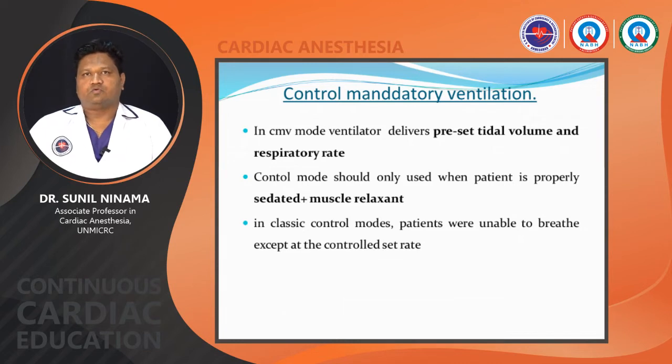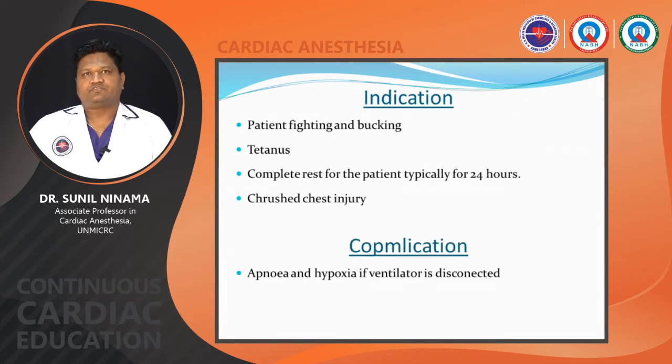In classic control modes, patients were unable to breathe except at the controlled set rate. Indications are patients fighting and bucking, tetanus, patients needing complete rest for at least 24 hours, and crushed chest injury. The complication is apnea and hypoxia if the ventilator is disconnected.